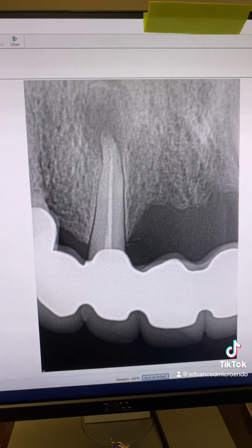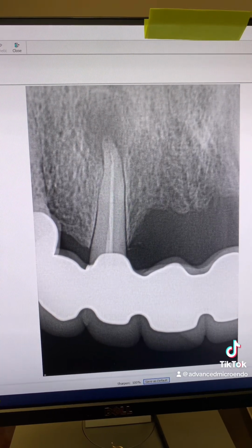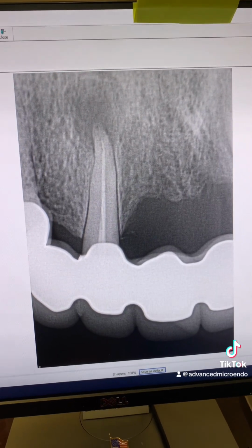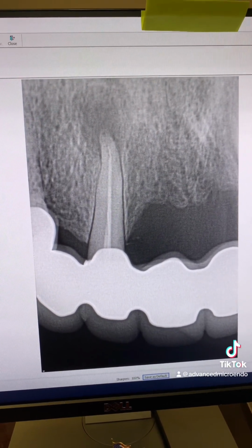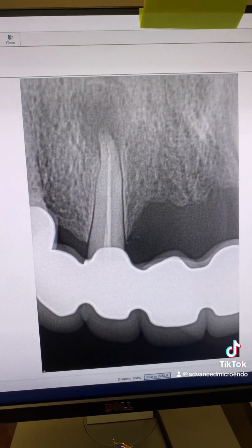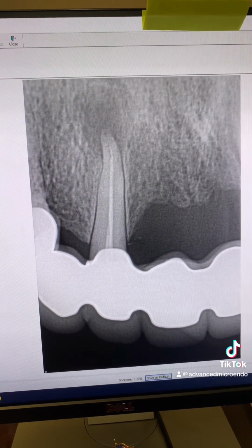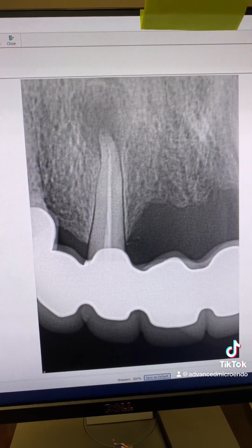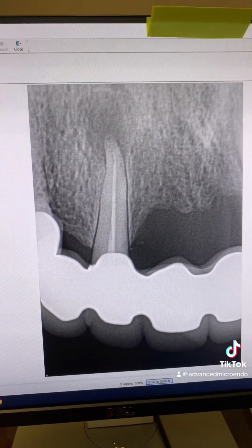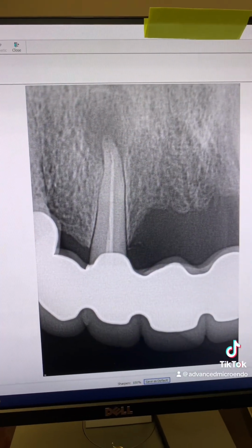So see what I mean? I know my limitations. I know what's best for the patient and what's best for me, and what's best for the dentist. So if I had tried, I would have probably come to the same conclusion. Probably the patient would have suffered, and as I said, I might have cracked the bridge or the abutment teeth. The dentist himself, who had cemented the bridge with temporary cement, had tried to remove it and couldn't do it. So unfortunately we had to go through this pretty brand new bridge to do a root canal on tooth number 5 and redo the root canal on tooth number 7. And that's what we did.